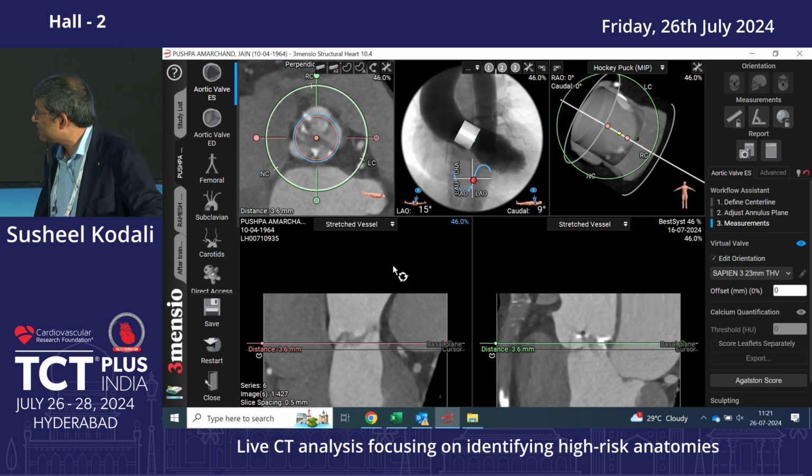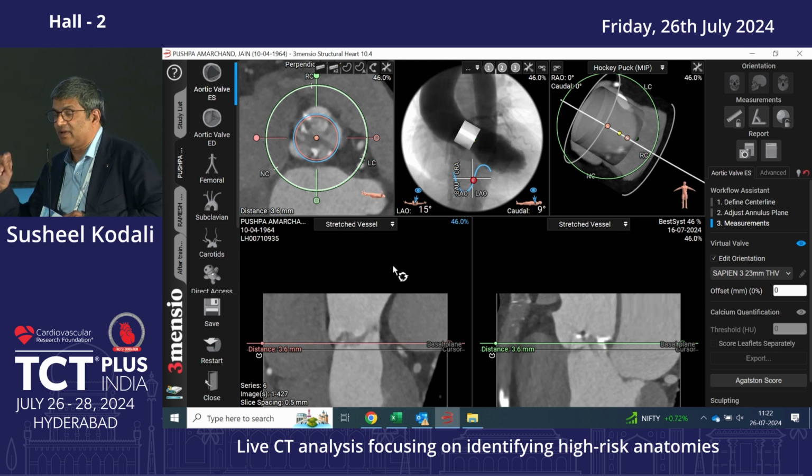But any other thoughts? In your patient population, how much are you using DASI simulations, Susheel? We're struggling right now because we're getting our hospital to integrate it. They got CMS approval, but the billing mechanism hasn't been sorted out. So we've only sent the truly high-risk ones that we're worried about. But it should be similar to HeartFlow. In the US, if the radiologist gets the scan, HeartFlow is a billable procedure for insurance. The radiologist can send the scan, it's analyzed, and the coronary tree comes back.